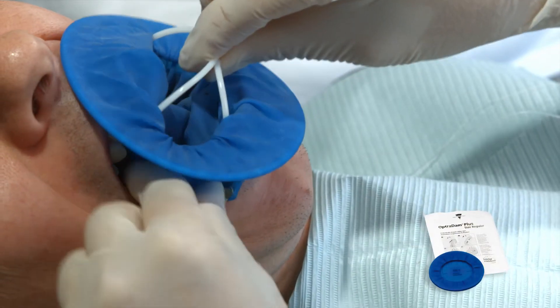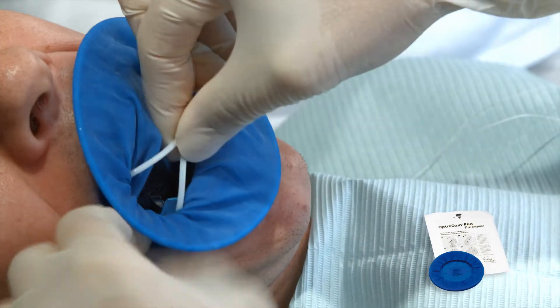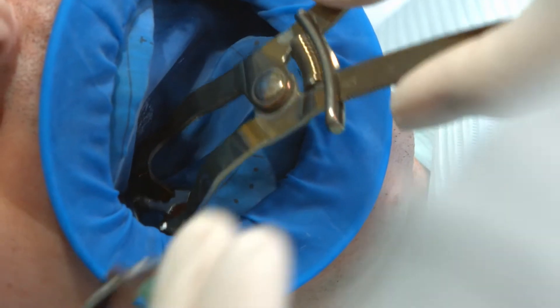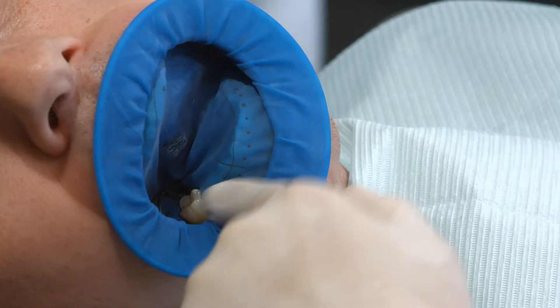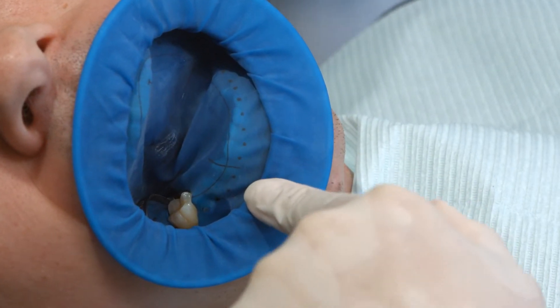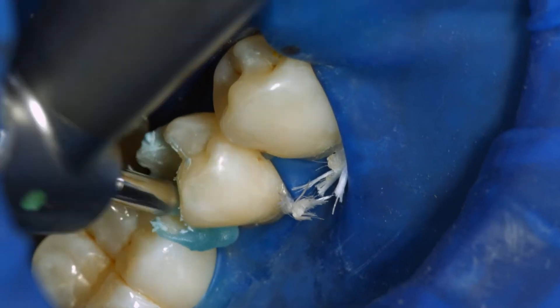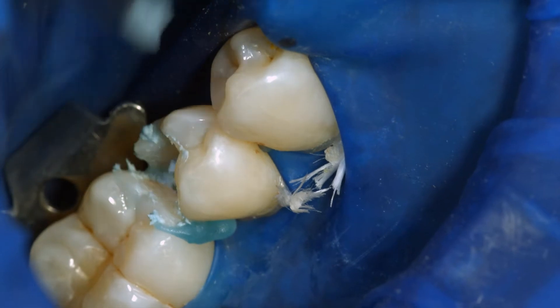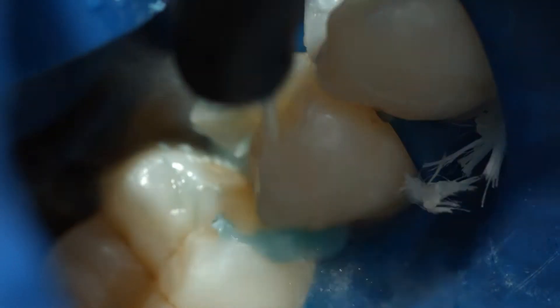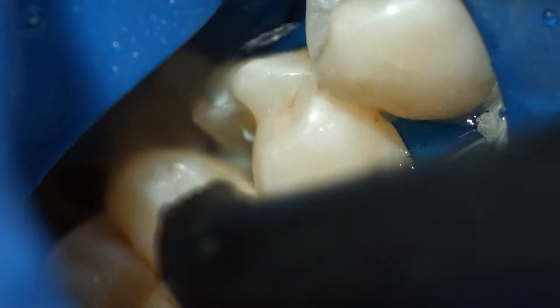When an adhesive luting protocol with composites is used, reliable isolation of the operating field is indispensable. Preferably, place an anatomically shaped rubber dam, such as the Optra dam, or alternatively use cotton rolls and a saliva ejector. Clean the preparation again with a polishing brush and a fluoride-free cleaning paste such as fluoride-free Proxit. Rinse the preparation with water spray and dry it with air. Avoid over-drying.